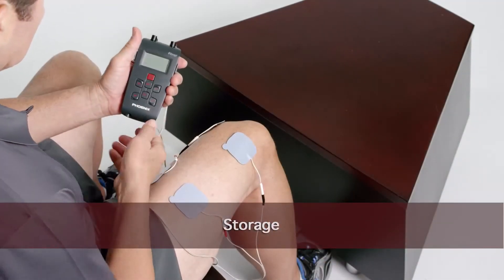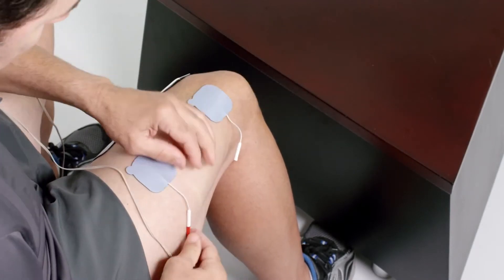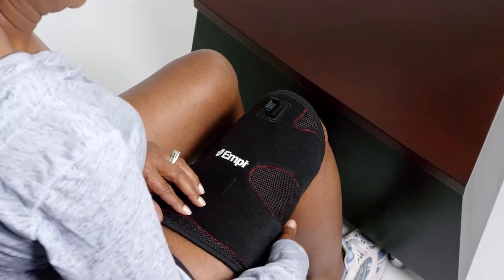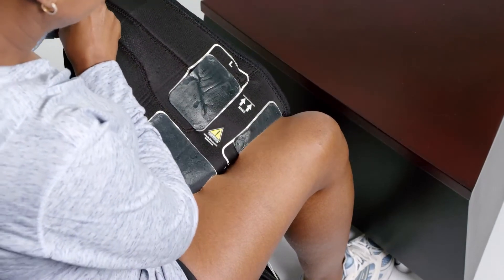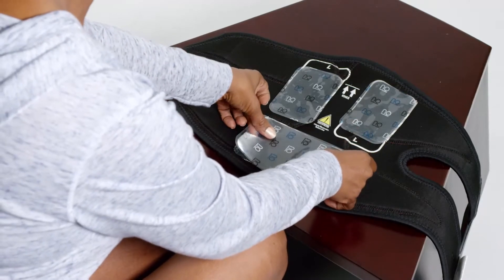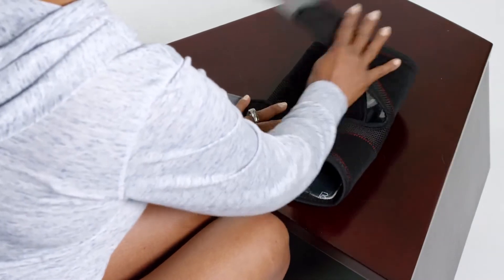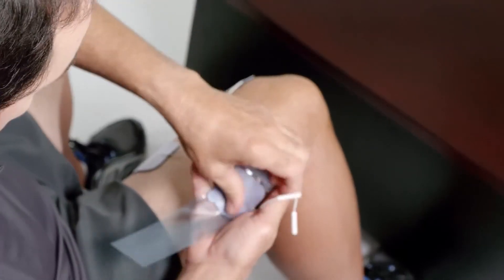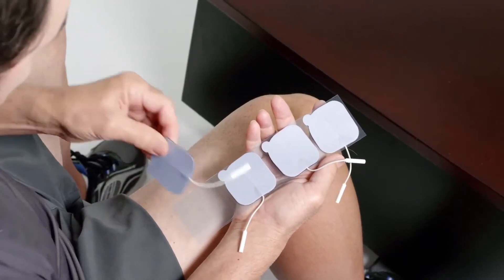Storage: When you have completed your therapy, turn the device off and disconnect it from the lead wires. Remove the lead wires from the electrodes or garment. If you are using the garment, remove the garment from your thigh, making sure that the electrodes stay attached to the garment and not on your skin. Replace the clear plastic electrode linings and gently fold the garment and return it to the Ziploc bag. If you are using electrodes directly on your skin, remove the electrodes from your skin, replace the plastic lining, place the electrodes back in their bag, and zip the bag shut.